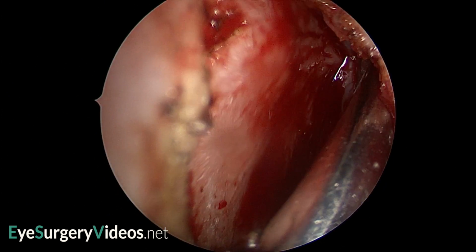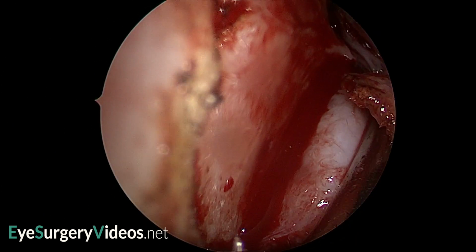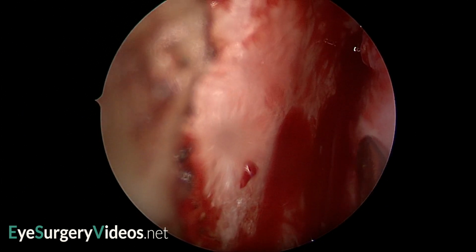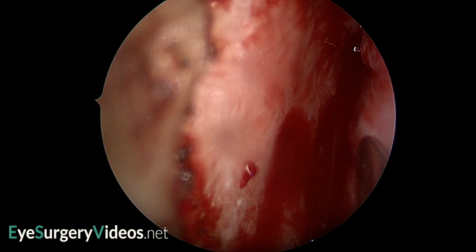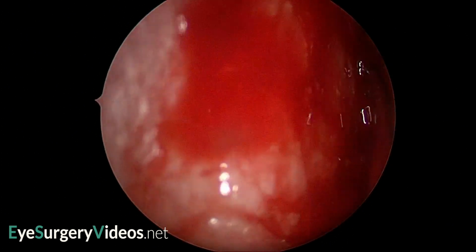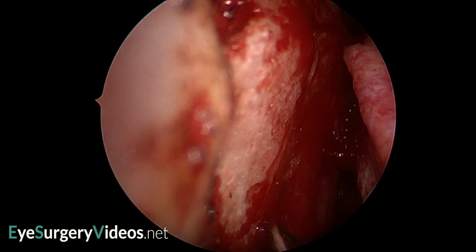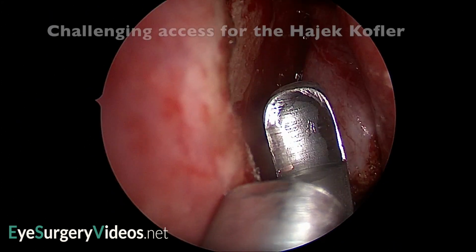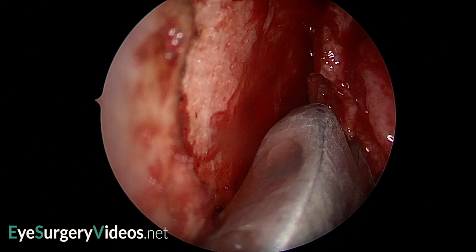At this stage, it is apparent that the maxillary process has a greater posterior extension than normal, and therefore the maxillary process lacrimal bone suture line is more posteriorly located. One can see that this creates more challenging access for the use of the Hayek Kerrison punch.